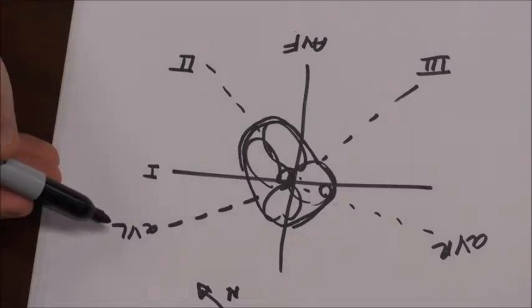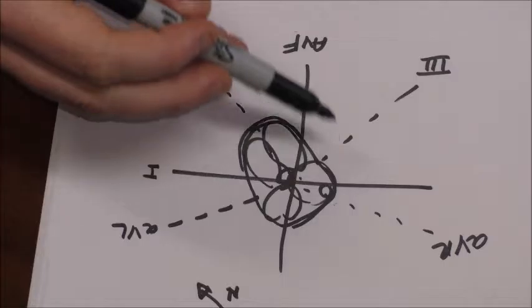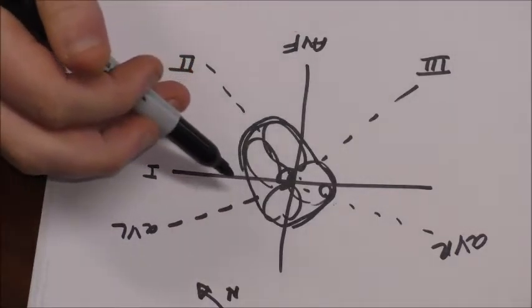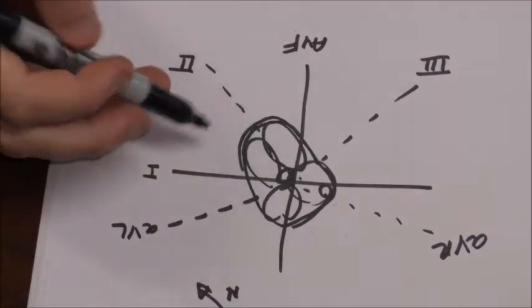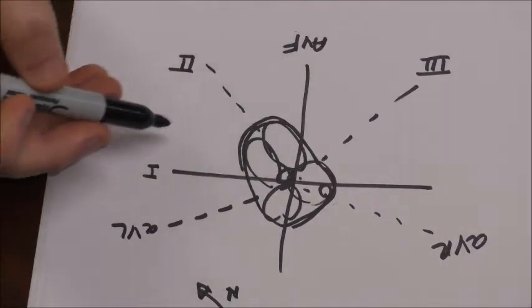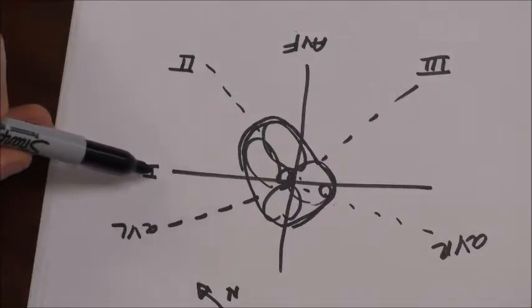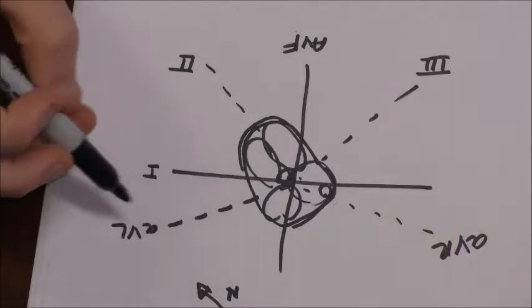So then you add one more dimension to that, is the fact that pretend that all these photographers are looking at this heart, but this heart is also in motion. Obviously in the chest it's fixed, but think of it as a race car, and photographer number 2, that race car is driving straight at him. Photographer number 1, it's kind of in direction, but not entirely. So you can think about it that way.